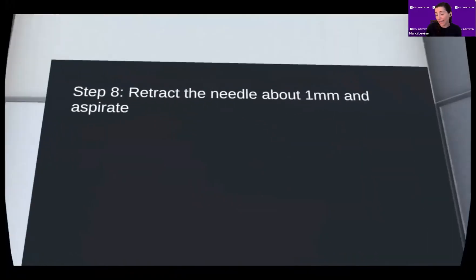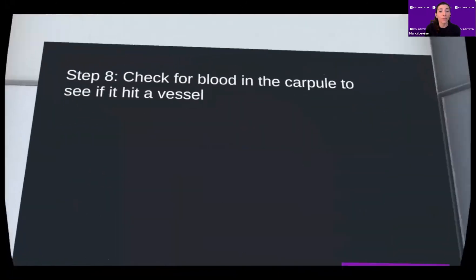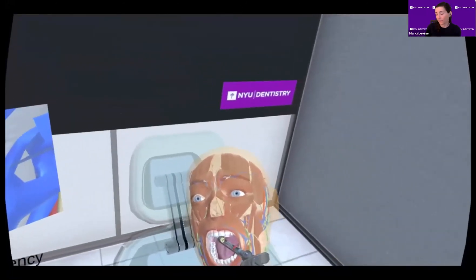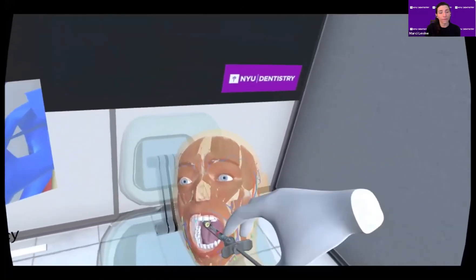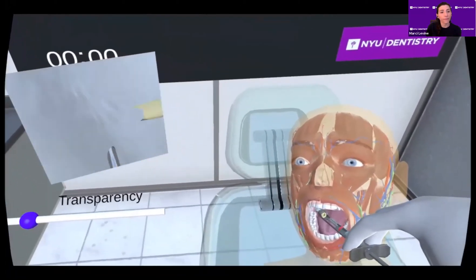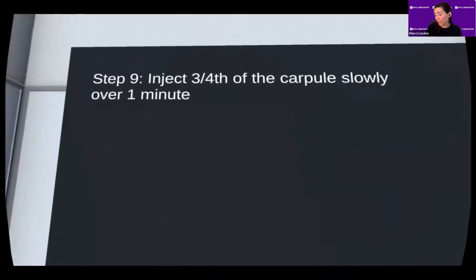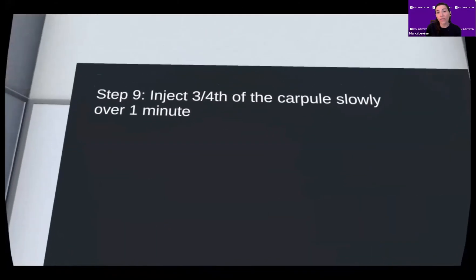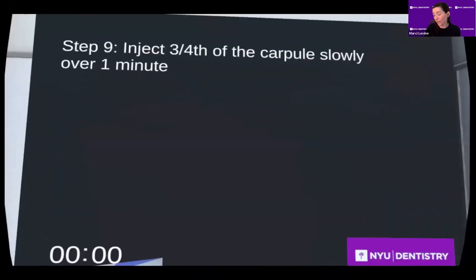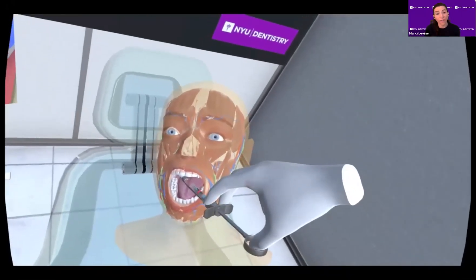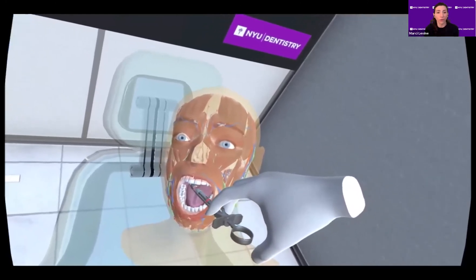The student tries again and aspirates. This aspiration is negative. Using the magnifying glass to confirm location, the student is able to successfully deposit anesthetic solution in the correct anatomical location. The core technique for this injection is followed and the student is walked through the steps for the delivery of an inferior alveolar nerve block.